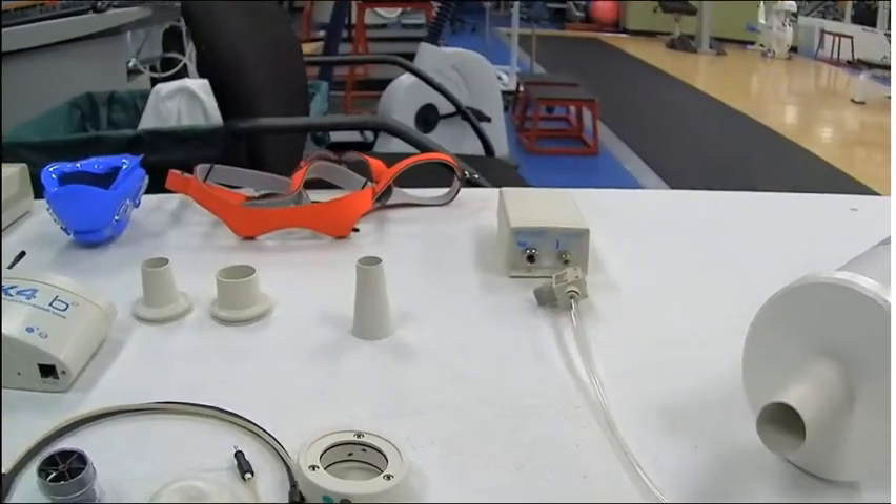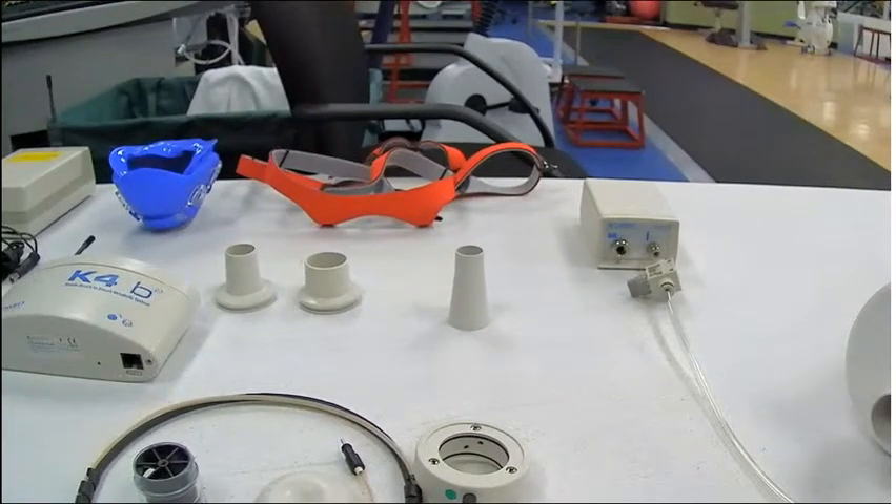On our right here, we have the 3 liter calibration syringe, and up at the top we've got the calibration box. There are three turbine adapters and a fan right here, with the turbine and the flow meter right here.